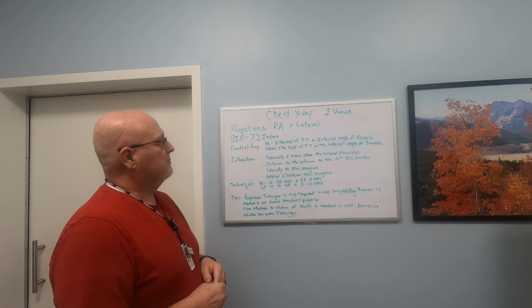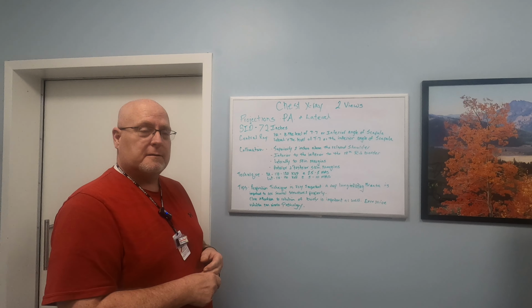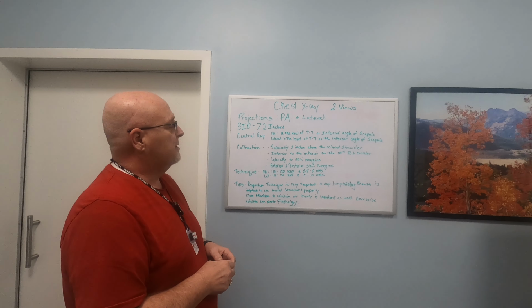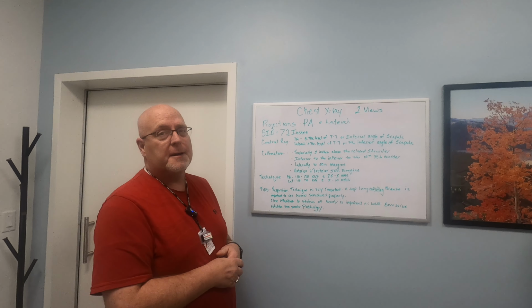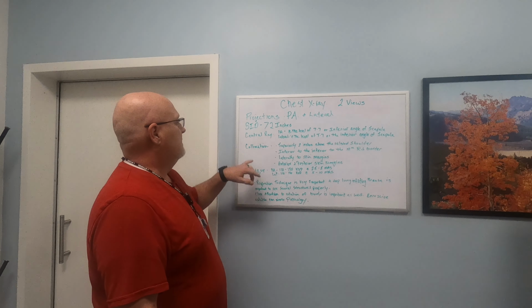So the projections that we're going to concentrate on in the urgent care are an upright PA and an upright lateral, a left lateral. We don't do very many specialized chest views here anyway. They are done, but not here, so we're not going to concentrate on them.